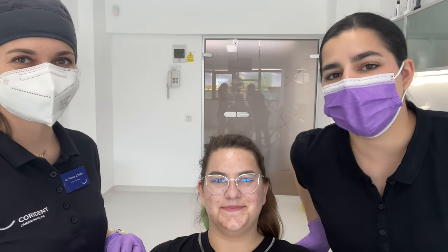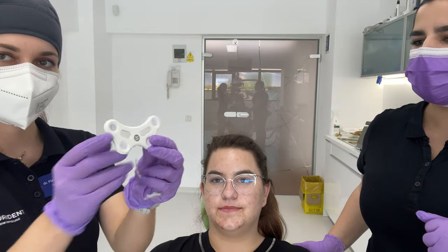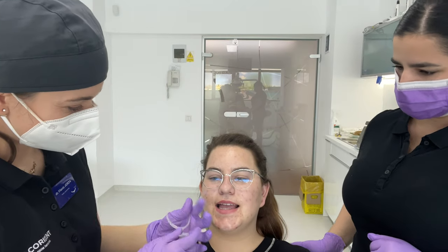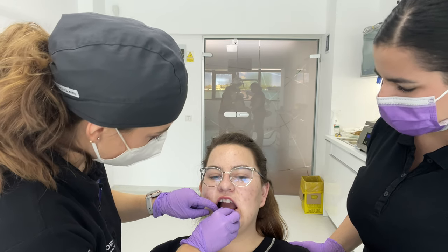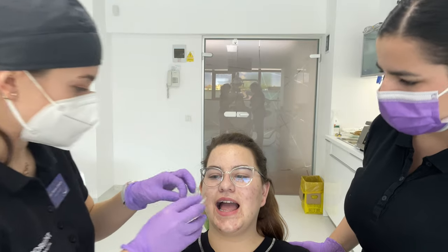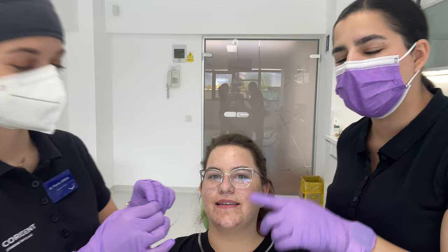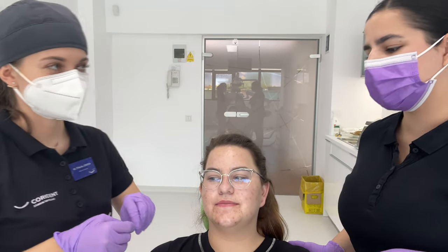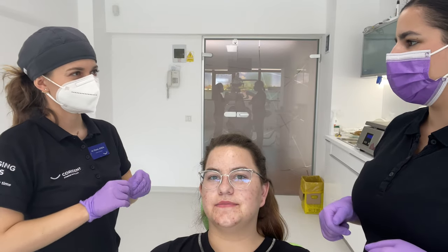Okay, so now we're going to mount the inferior sensors. Yes, this one. It's like a butterfly. How do we do that? And now we check the motion. That is just one time use, and we had to measure the dimension to see how big it is, and now she's cutting it a bit, because it's a bit too long. Yes, it's too long.